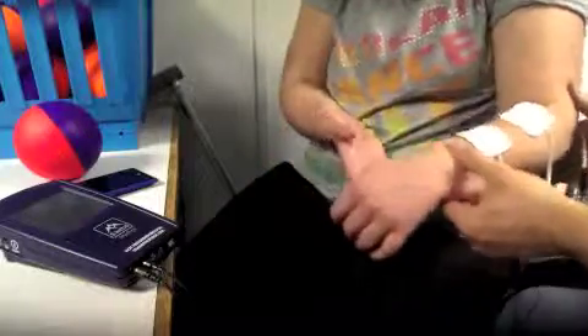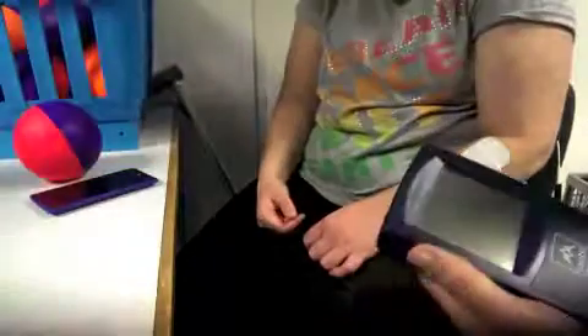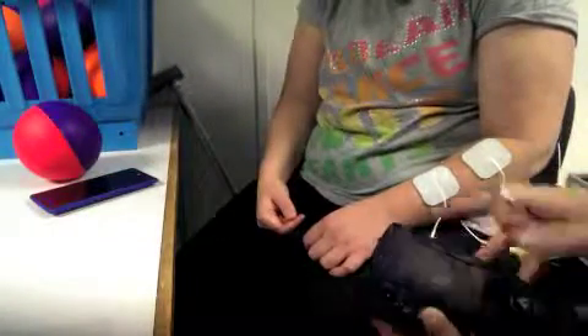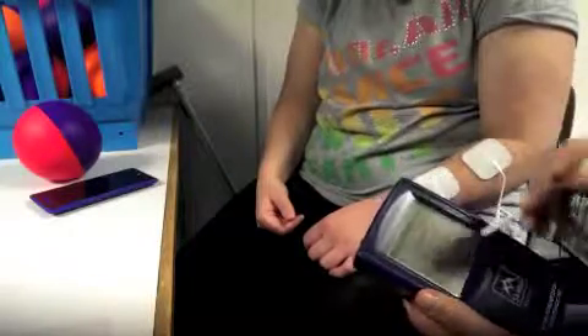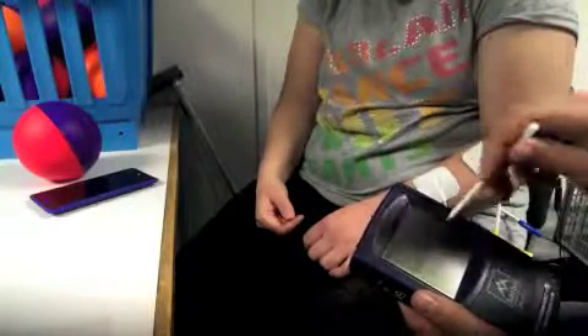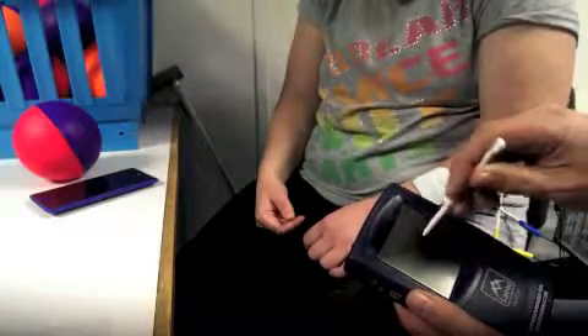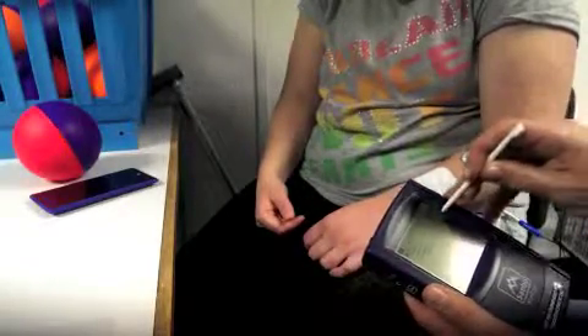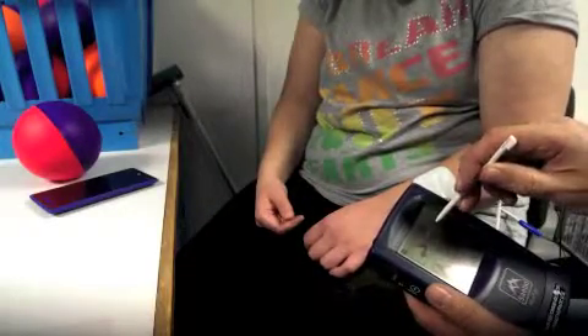Just before I put the Saberflex on, I'm going to check that I've got the correct position for the pads to get our extension. I've turned the Myotrack Infinity on, I'm going to press start, go into stim mode, just use a program, choose the arm, and go for strength.